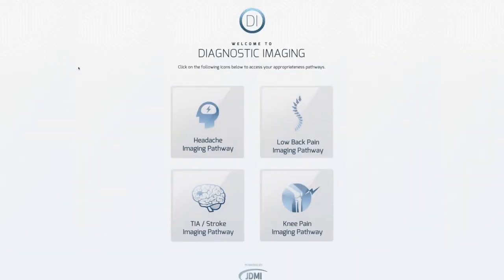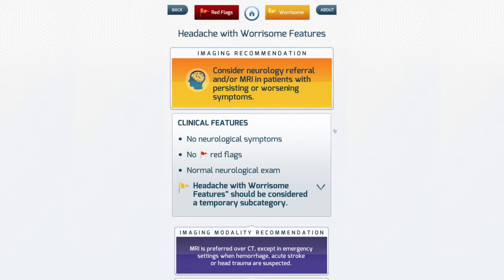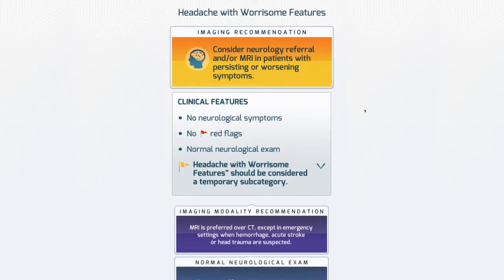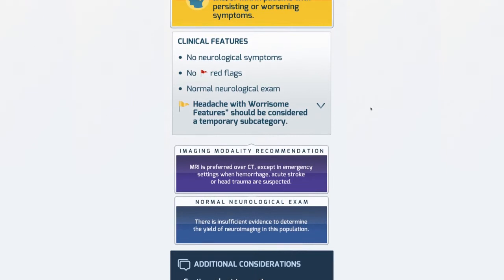For example, if your patient comes with a headache — let's say a headache that has worrisome features — the imaging recommendation pops up immediately, followed by clinical features.